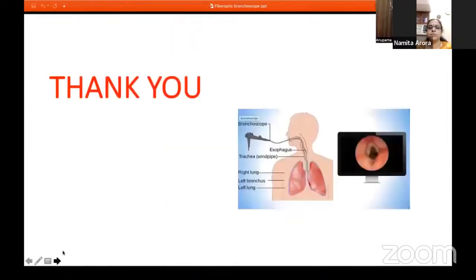I come to the end of my talk. The possible questions which can be asked in the exam can be how to anesthetize the airway for an awake fiber optic intubation or awake nasotracheal intubation, and you can be asked in the viva the various parts of the fiber optic scope. Thank you so much.